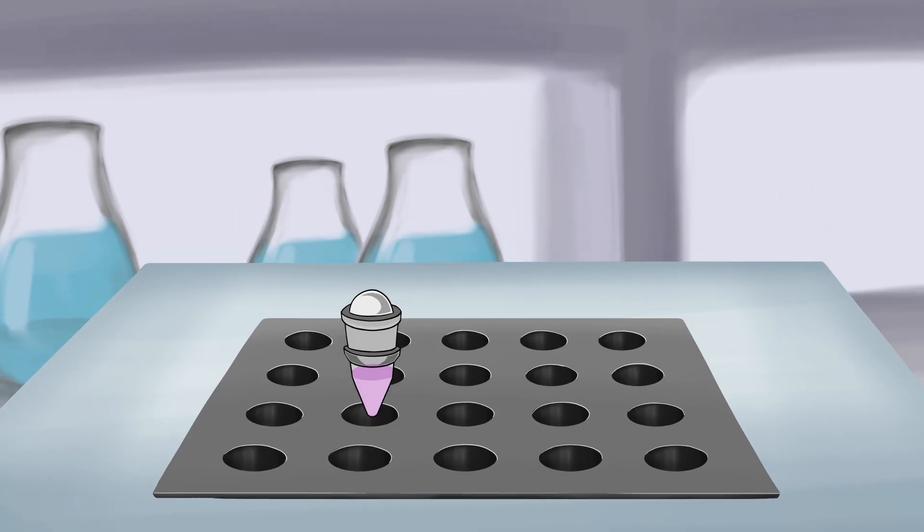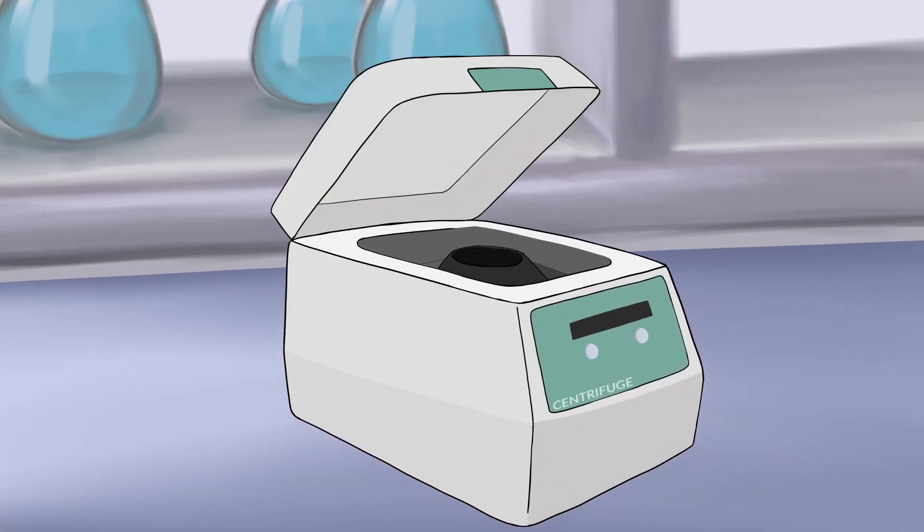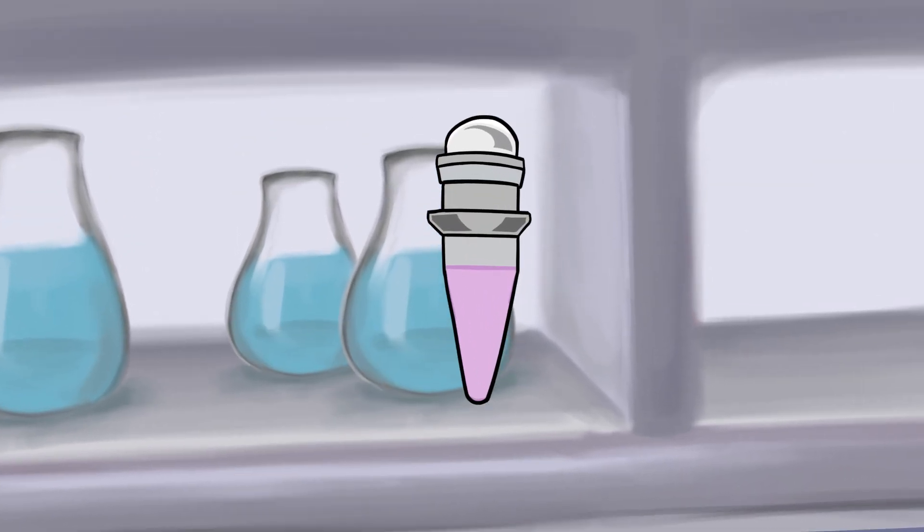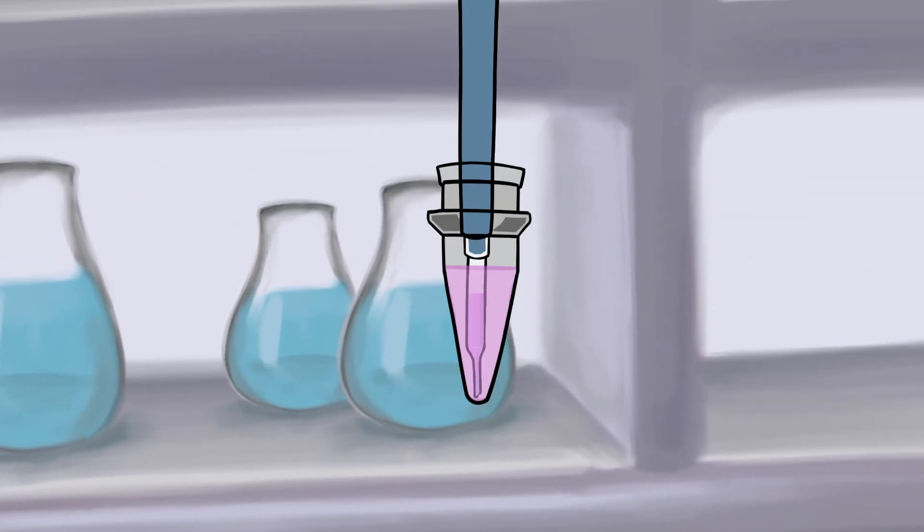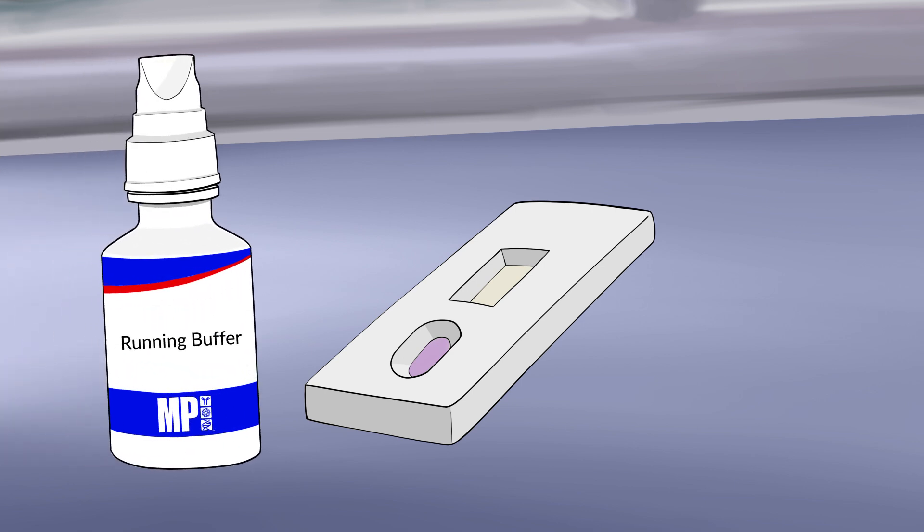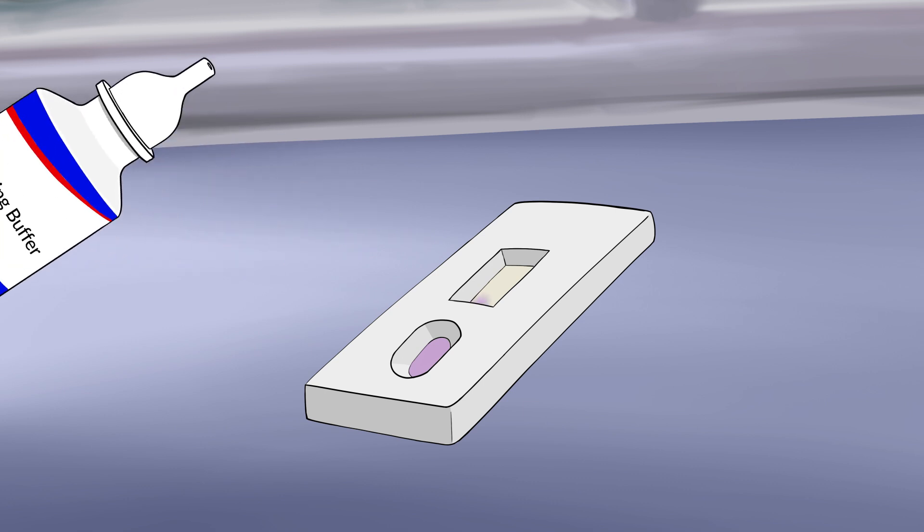After incubation, allow the reaction tube to cool down to room temperature, then briefly spin down the mix. Next, pipet 5 microliters of the reaction mix and load it into the sample well of the detection device. Add 3 drops of running buffer to the sample well and wait for 2 to 5 minutes for the results to develop.